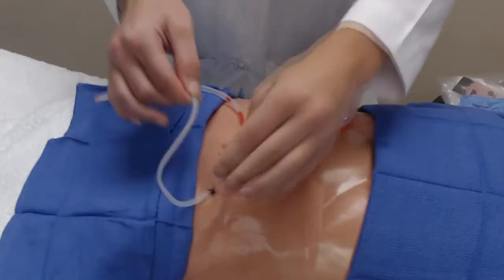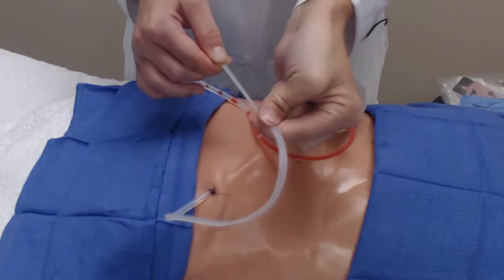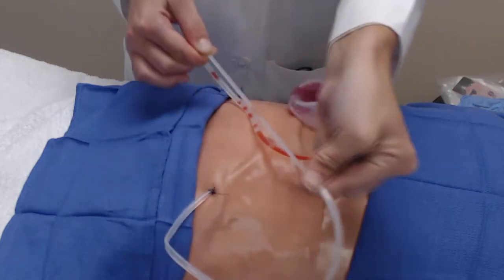Sometimes, if you have a clog or a clot, you might have to do this stripping procedure more than once for every time you do it throughout the day.